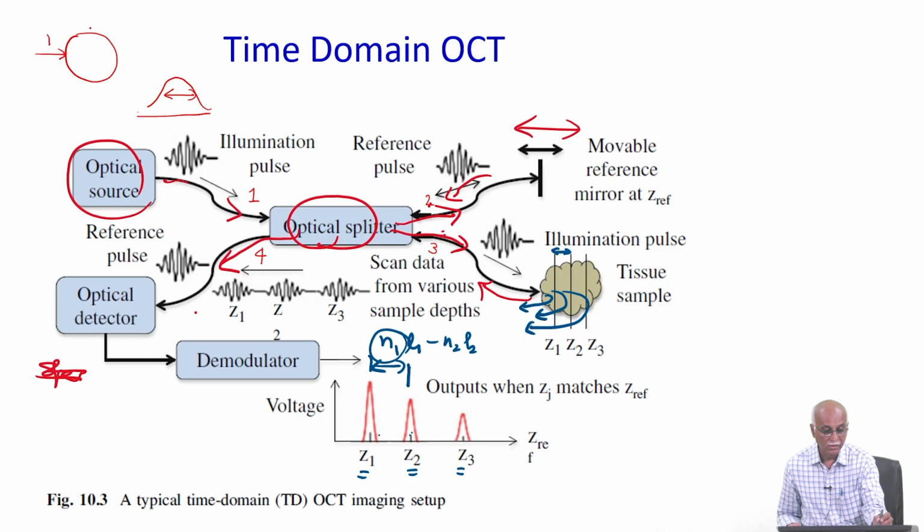Input from 1 gets to 2 and 3, while the reflected signal gets coupled to 4 through this beam splitter cum circulator. Inside this device there will be optical components basically to ensure the beam splitting operation, circulator, etc. Only thing is, it is in a compact form and coupled with the fiber. The beam splitter components, etc., are very small in size, and they are coupled.